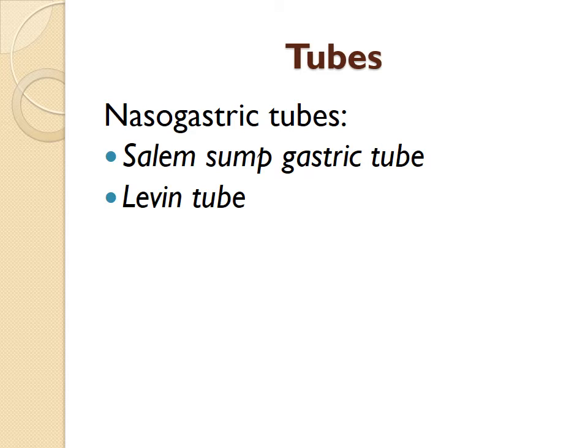At the very end of that blue port, we usually place a white and blue cap, which is referred to as an anti-reflux valve. And in that cap, which you will see in the classroom, there is a piece of filter paper in there, and it allows for air to come through the little holes that are visible in that anti-reflux valve and air to pass out.